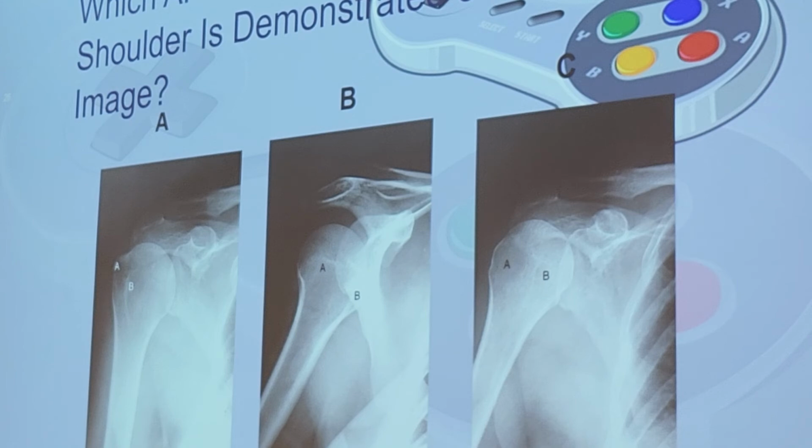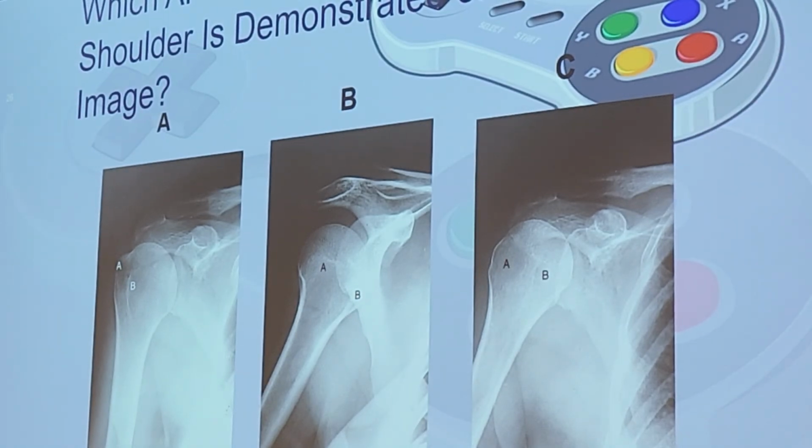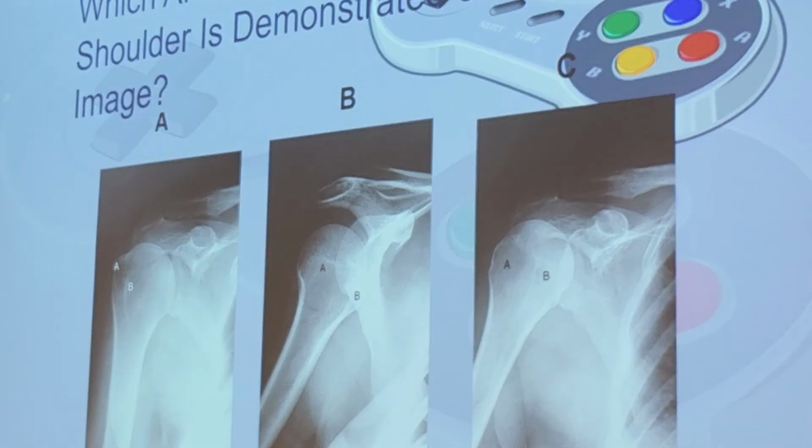Oh, okay, the epicondyles are parallel. What position is it? Neutral. That's still external. So that question we asked three different ways right there. Keep that in mind. That's not me being sneaky, that's me preparing you for how the registry is gonna be sneaky.